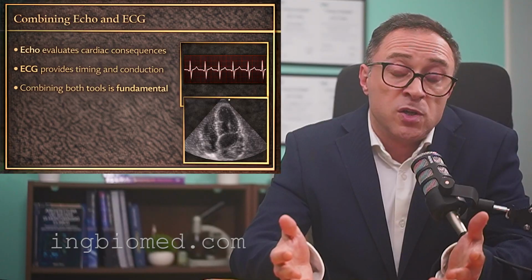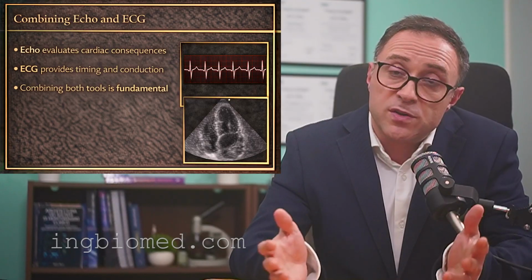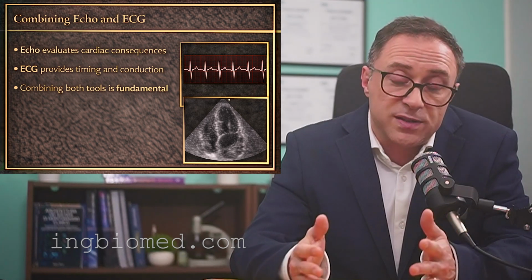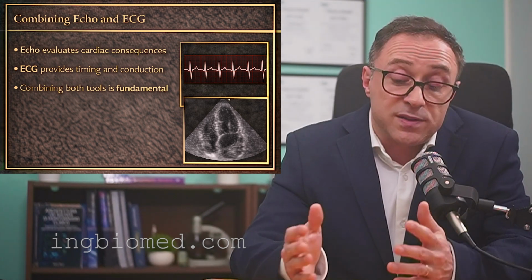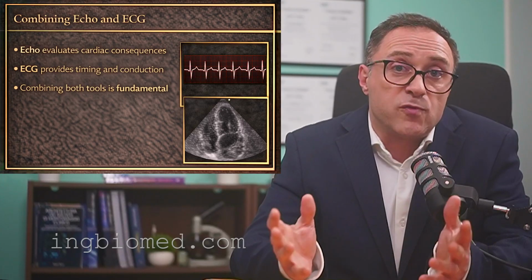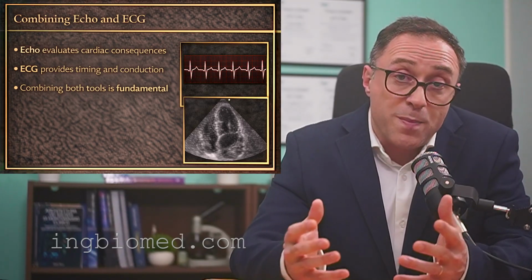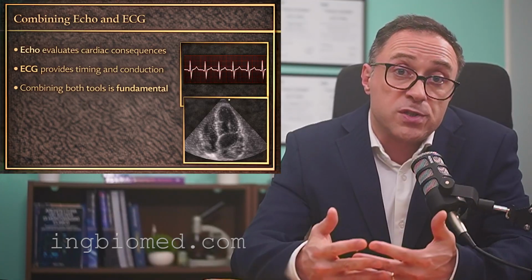Echocardiography allows us to evaluate the consequences of these electrical disorders on cardiac function. At the same time, the ECG provides information about timing and conduction, so combining these two tools is fundamental.